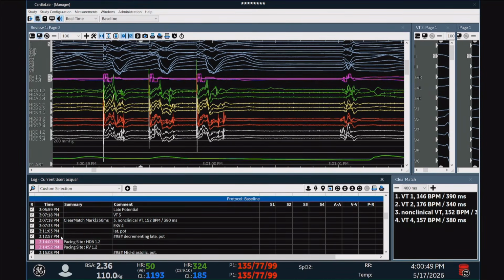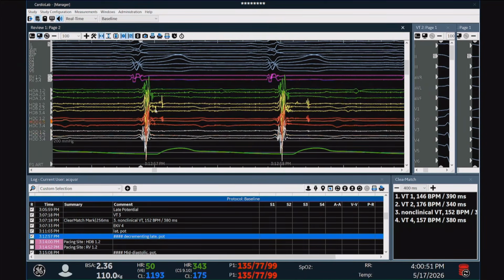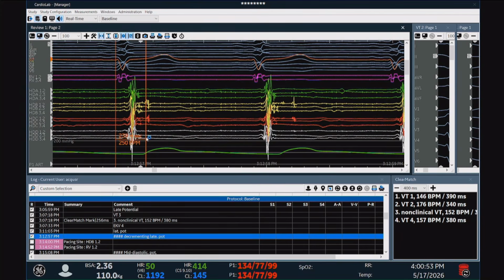So there were a lot of cardioversions, and during sinus rhythm there was good enough. No, we didn't have to actually do the S3 map because there was, as you can see, even some spontaneously decrementing conduction within the scar. So that's definitely a target for the ablation.